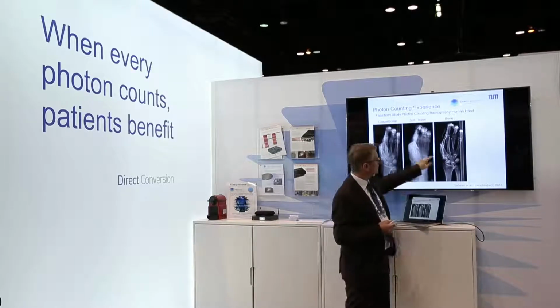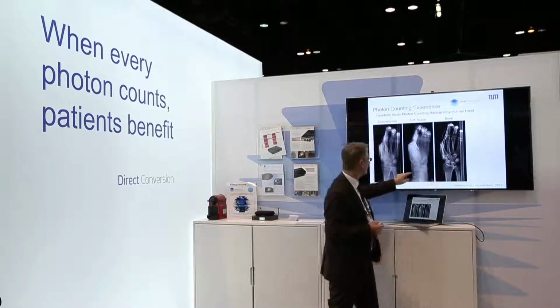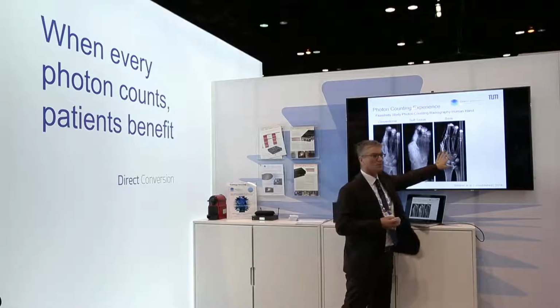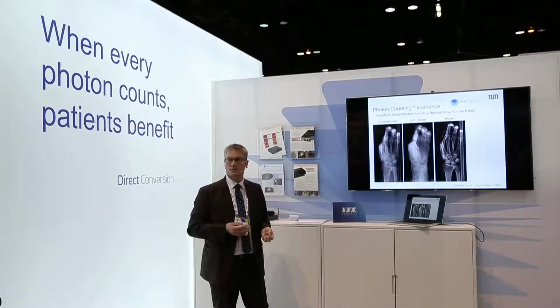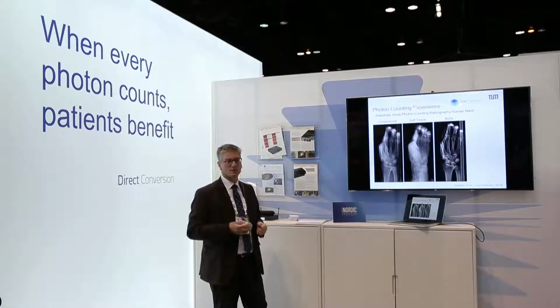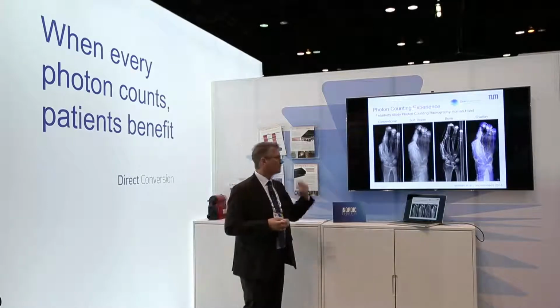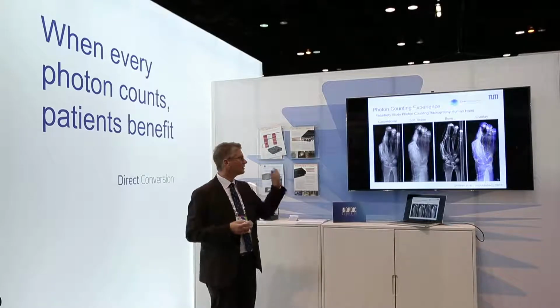And if you look closely, for example, you see little pieces of bone here or fragments down here. That is actually much better displayed than in the normal image. So here you get a pure bone image, and you might actually have access to microfractures more easily than in the standard radiographic images. So I think also besides CT, you can have quite a few applications of these detectors. Now you can be creative about how to present that to radiologists, or in an overlay, or in different ways.